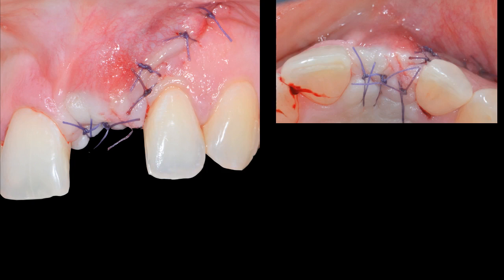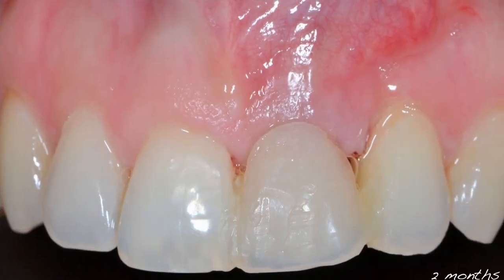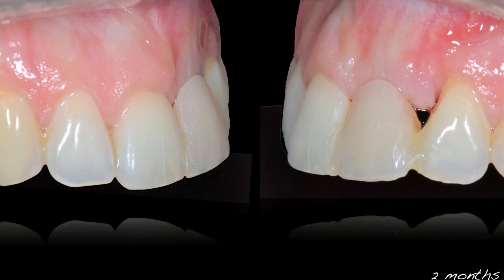This is at about 2 months later, when the patient had the provisional tooth bonded to the adjacent teeth, so no pressure was done on the flap. We allowed, of course, for more than that for the healing, about 5 months, as I said previously. This is the profile shots, as you can see, distal and mesial. You can discern some deformity on the buccal plate, but it has been restored.